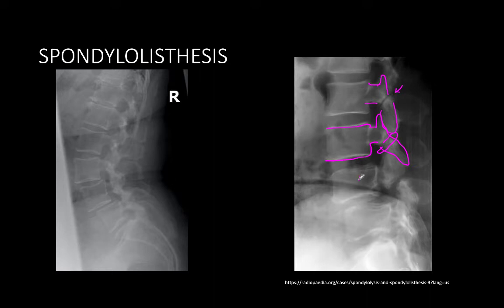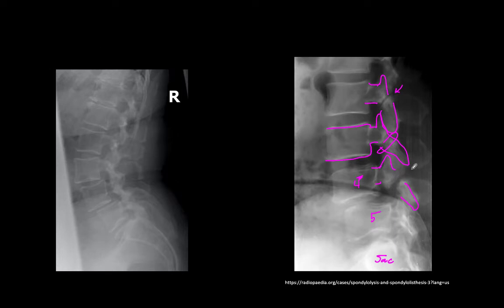You'll notice when we come down to this vertebrae, and I say this one because it's hard to tell, is this the sacrum? Probably. This is probably L5 here. It's probably L4. But you'll notice the pedicle, superior articular process, inferior articular process is all the way over here, and then the pars defect.